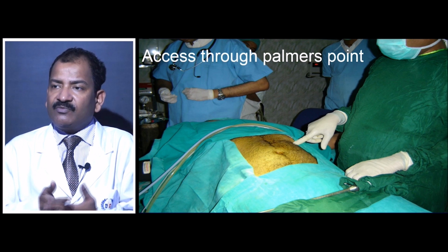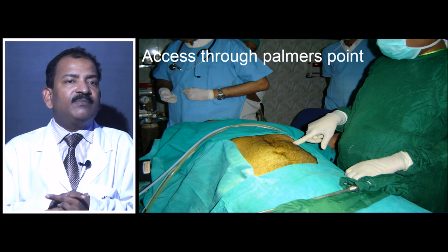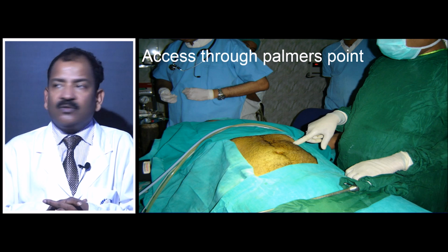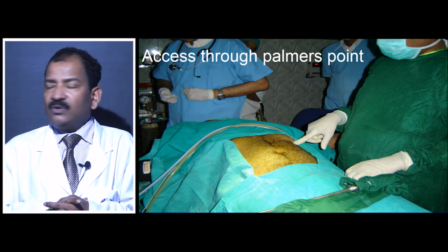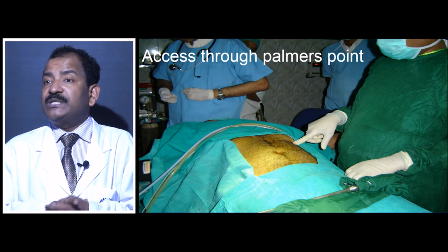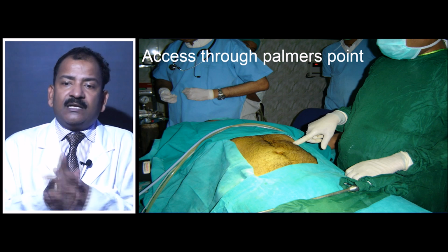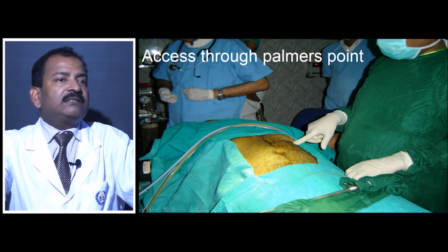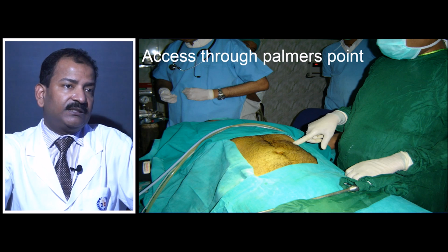I am not saying to perforate the stomach, but what I mean to say is that perforation of the stomach is better than perforation of the colon or rectum and others. So, that is why NOTES is performed transgastrically. The only contraindication of Palmer's point is splenomegaly, then you will not use it.